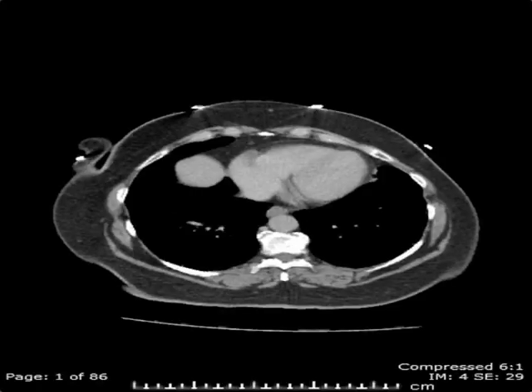The following is a CT scan of the abdomen and pelvis performed with intravenous contrast. We'll start at the lung bases and scroll inferiorly.